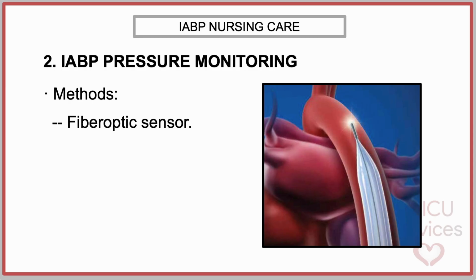From a practical standpoint, setup is straightforward. The fiber optic cable integrated within the catheter must be connected to the designated optical port on the IABP console. Once connected, the system will prompt for zero calibration. In most current platforms, the zeroing process is automated after connection. However, during therapy, a new zero can be performed as described by the manufacturer.